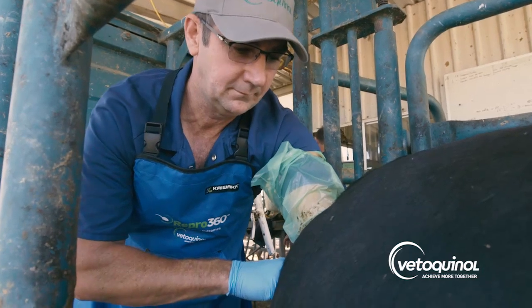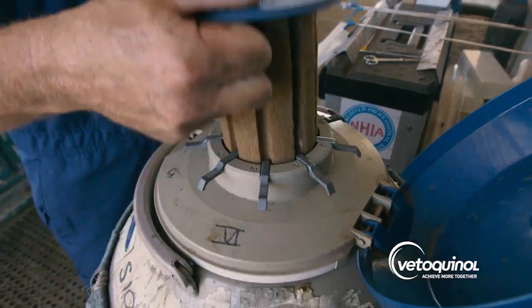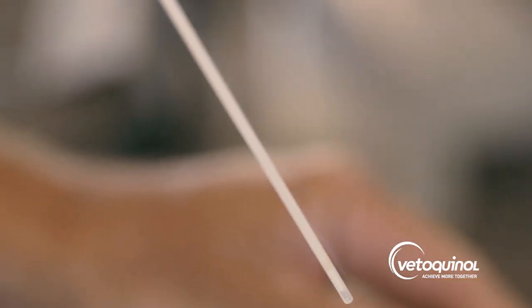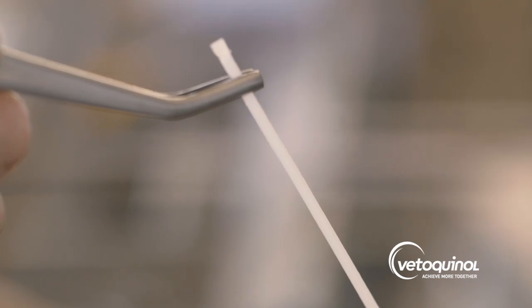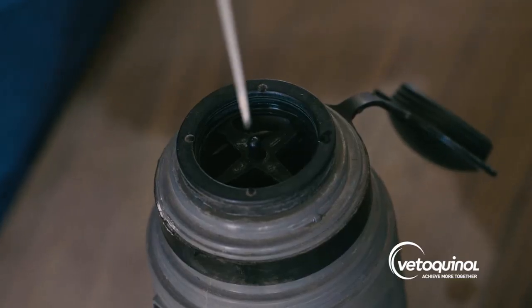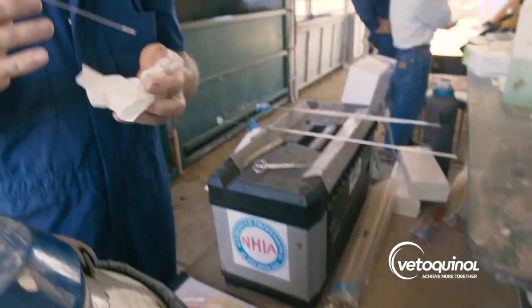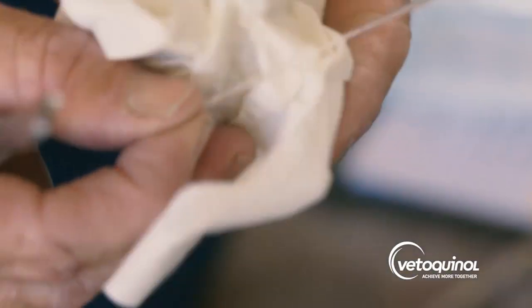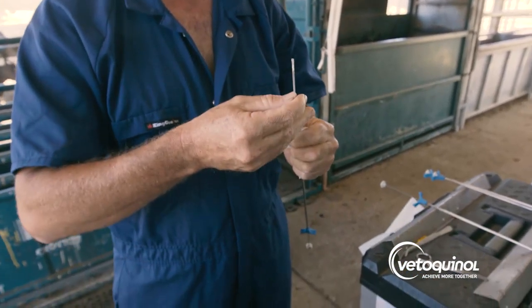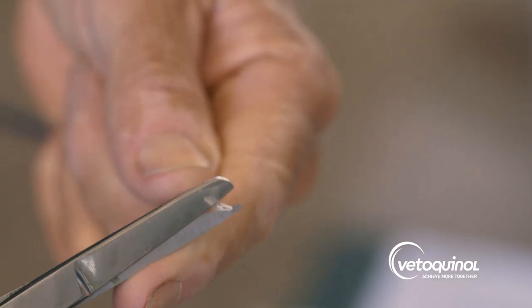We recommend that your cows are AI'd by an experienced technician. The AI tank contains liquid nitrogen that stores the frozen semen straws. The technician removes the straw from the tank and thaws it in a water bath at 35 to 37 degrees. The technician removes the straw from the water bath, dries it, then loads it into the insemination pipette, also known as the AI gun, and cuts the end off.